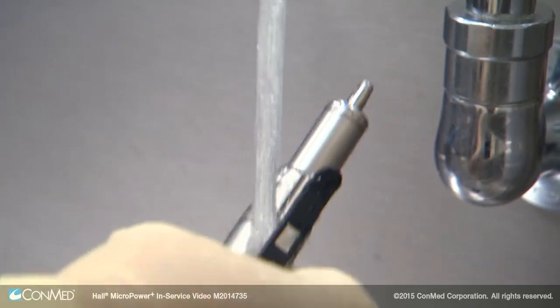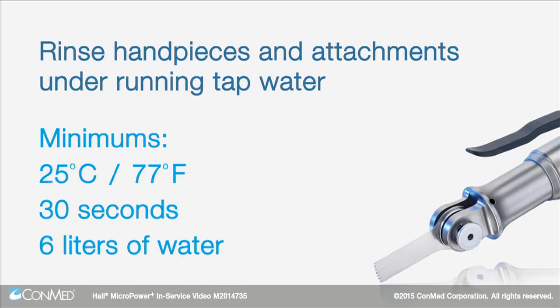Remove all traces of soap by rinsing the handpiece and attachments under running tap water with a minimum temperature of 25 degrees Celsius or 77 degrees Fahrenheit.